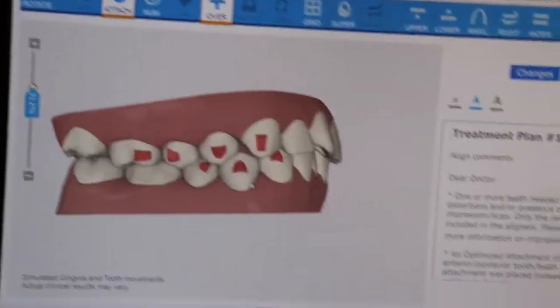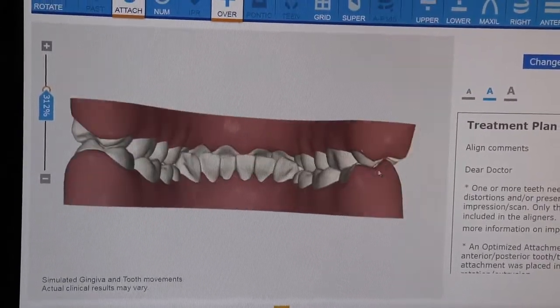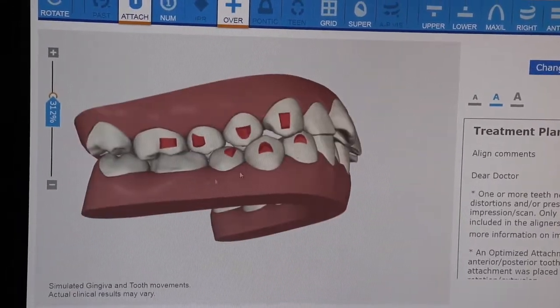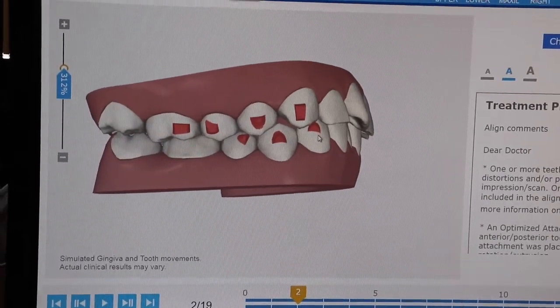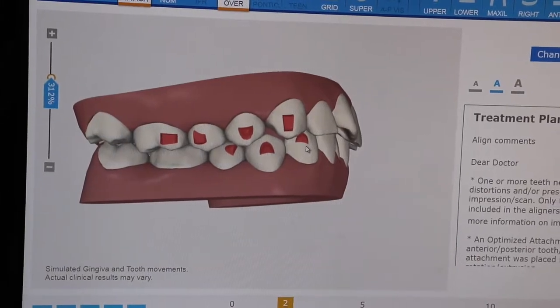We'll place all the attachments. There's little red dots — that's where the attachments are going to be at. You can see it's canine back on both sides, nothing on the tongue side, which is always nice. They're going to stay on for the duration of treatment. They're tooth-colored, nothing too crazy — you won't really be able to see them. If they pop off between appointments, give us a call. We can pop it back on, it's not a big deal.